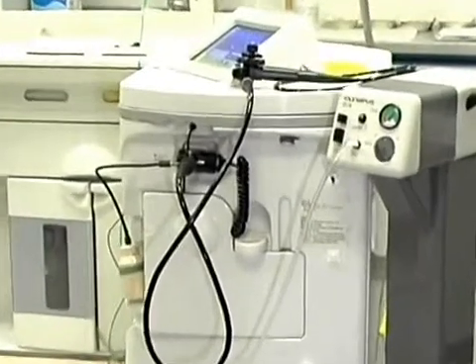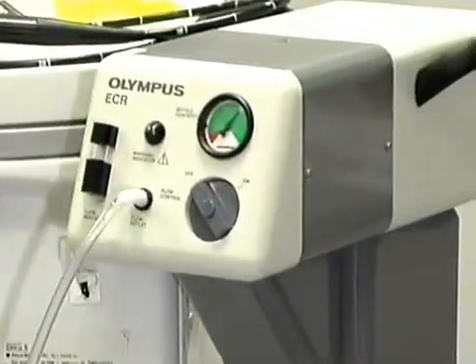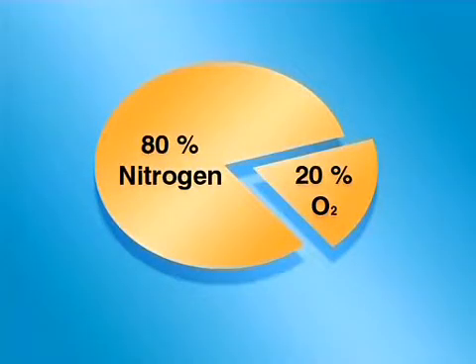Carbon dioxide, CO2, isn't much used for colonoscopy, but it probably should be. Nearly 80% of the air insufflated into the colon is nitrogen, an inert gas which isn't absorbed. The patient is inevitably left distended at the end of the procedure.